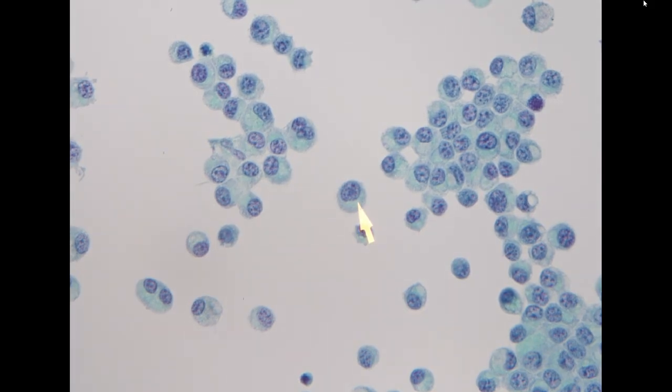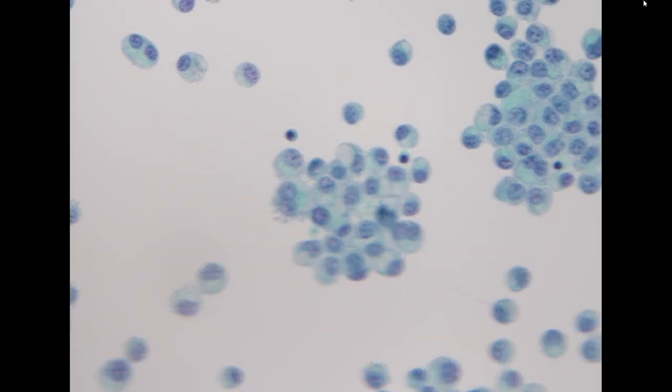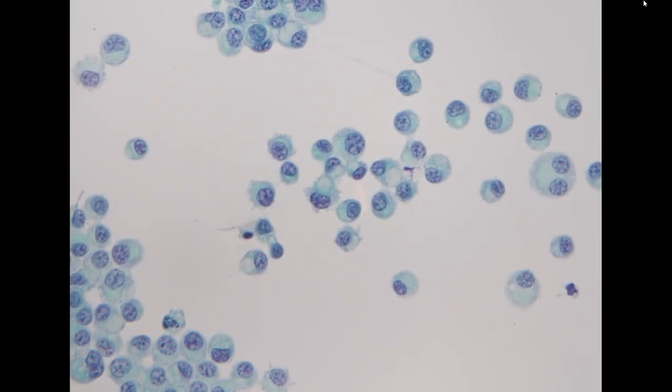However, for a plasma cell, we won't see something like this. This is a cytoplasmic vacuole. In this vacuole, it looks like there is some orange or yellowish stuff inside. It looks like mucin, and it's not only one. It is throughout this specimen, over here as well.